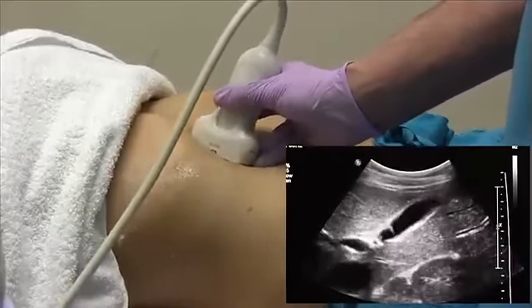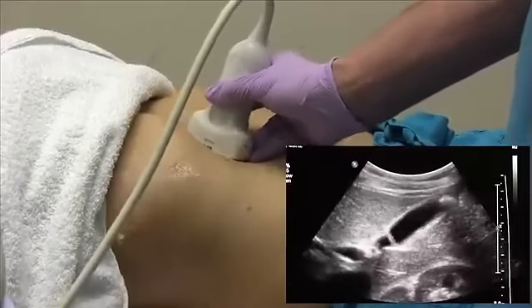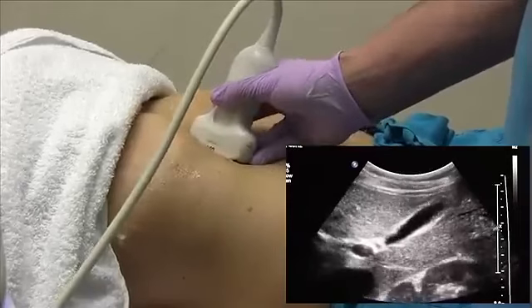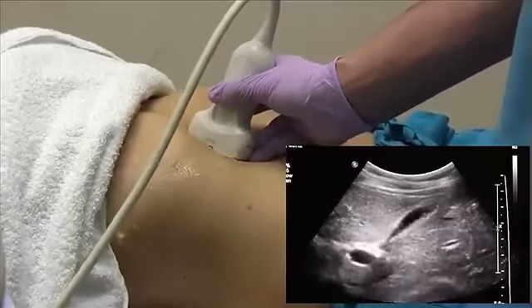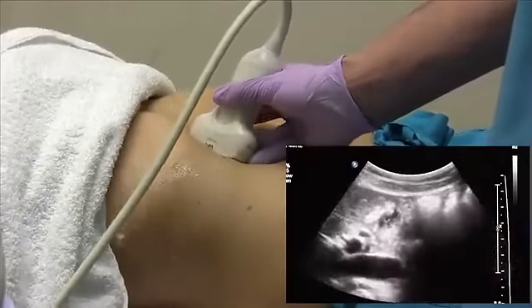And so again, you might not be perfectly sagittal to the body to get a sagittal gallbladder. And from here, once you find that elongated gallbladder, you just sweep through.